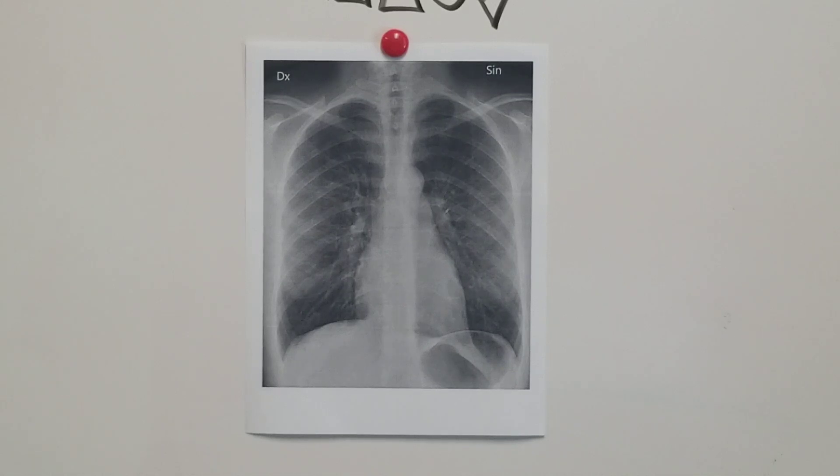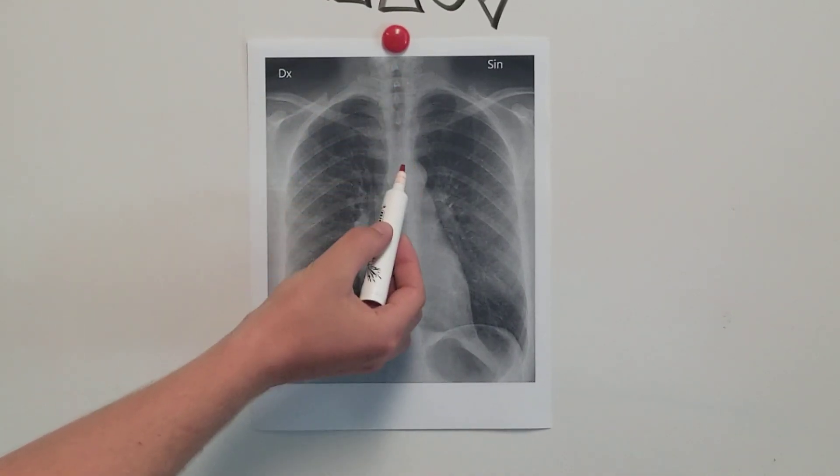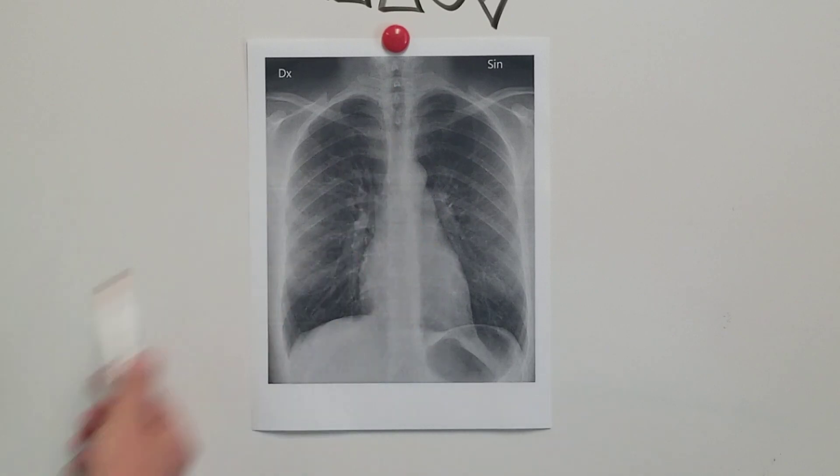A first is airway. You're going to look right here and make sure your airway is midline. You don't have any tracheal deviation. You can see the airway nice and clear — there's no obstruction, no foreign bodies, etc.